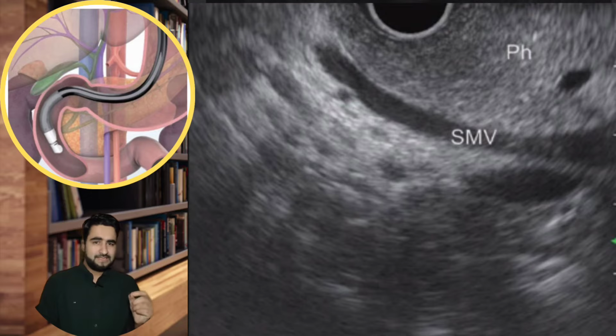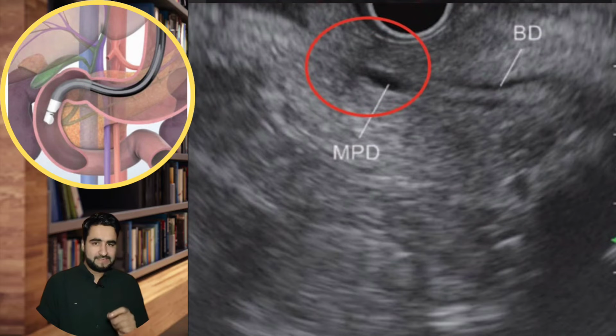Try to follow it until you see a vessel that flows into the superior mesenteric vein. Observe carefully that this anechoic structure that flows in superior mesenteric vein on the left side of your screen is pancreatico-duodenal vein. Now, as you observe the head of pancreas, while slowly withdrawing the scope, two luminal anechoic structures will be visualized. These two tubular anechoic structures are bile duct and pancreatic duct.